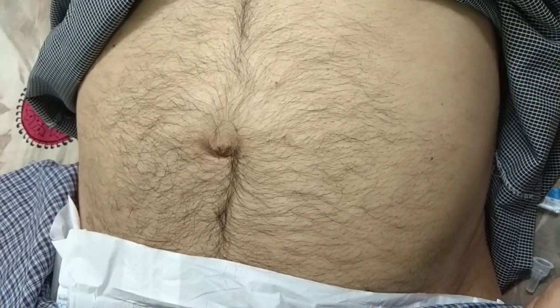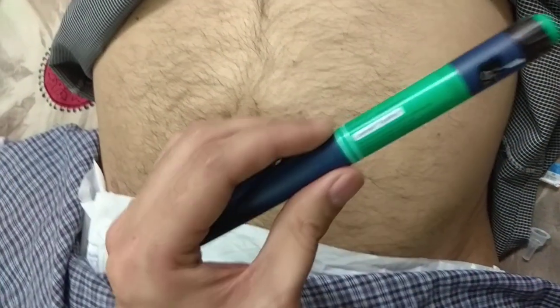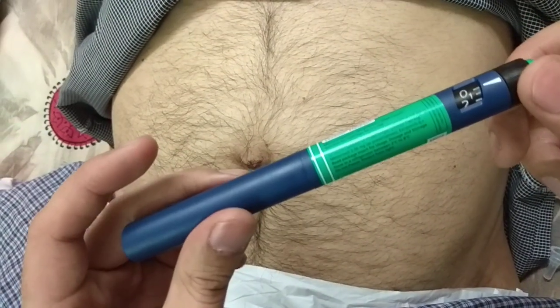Discard the waste properly, and the pen is ready to use for the next dose.